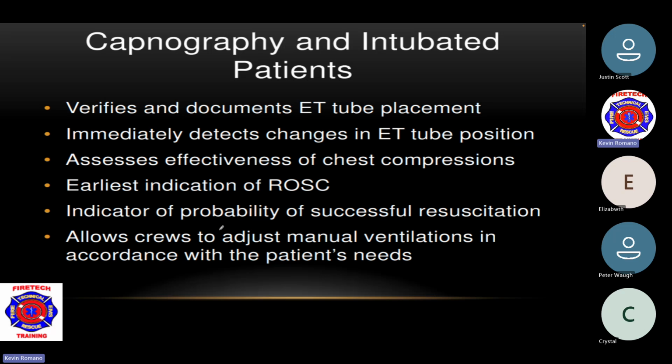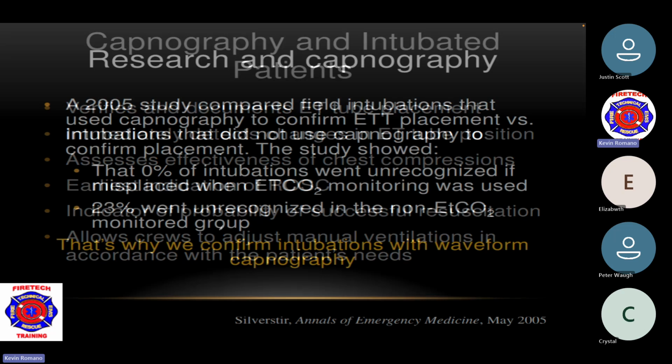So we're going to talk about vasodilation, vasoconstriction, and head trauma, hemorrhagic strokes, things like that, where this can make a huge difference in patient outcome. The old days of hyperventilate a patient are gone. We need to look at whether we need to hyper or hypoventilate depending on current status of end tidal CO2 readings. And we'll get into that here in a little bit.